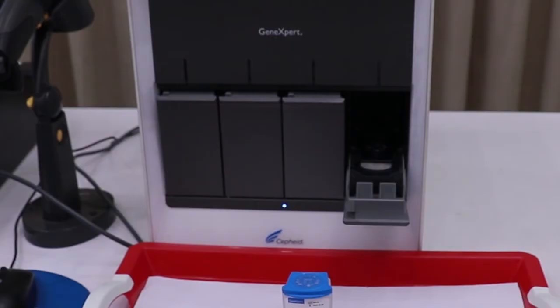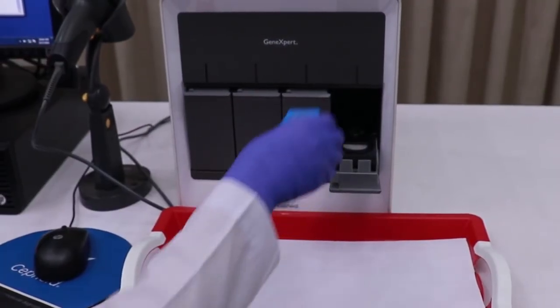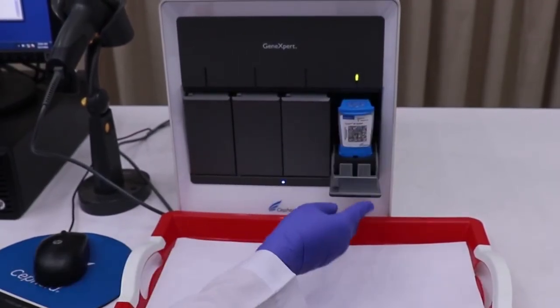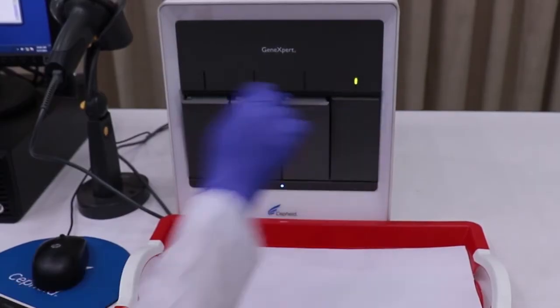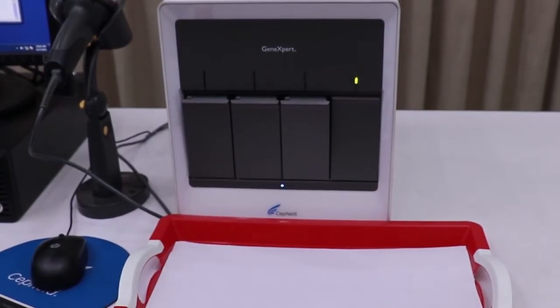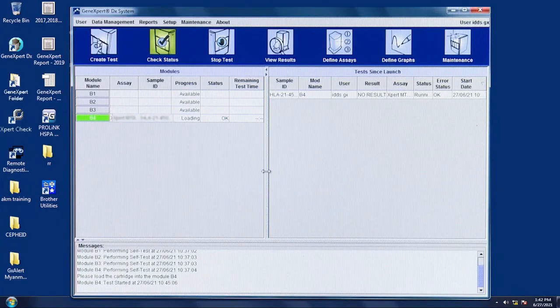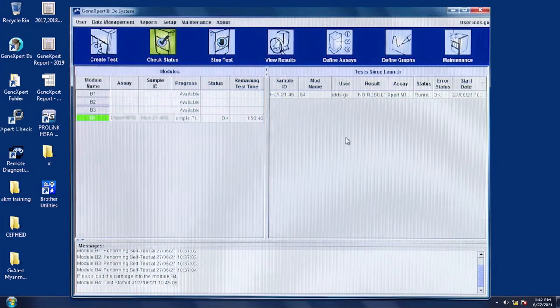Load the cartridge firmly into it and close the door. The test starts, and the green light stops blinking. Wait until the system releases the door lock at the end of the run. It will take nearly two hours for Expert MTB-RIF Test.